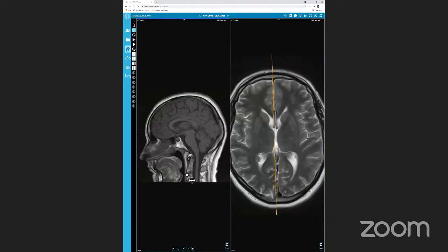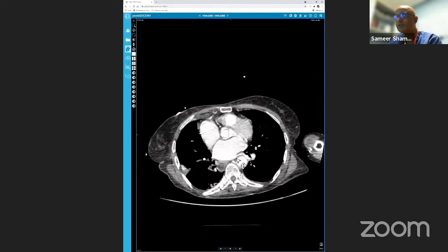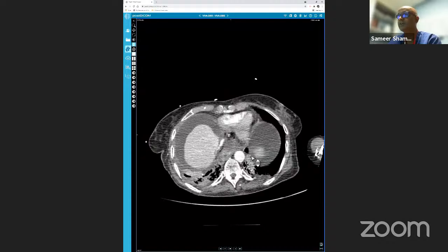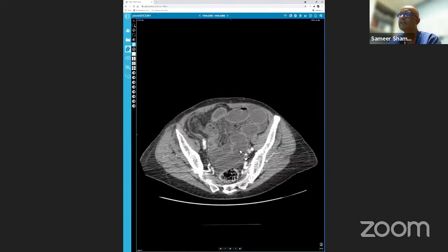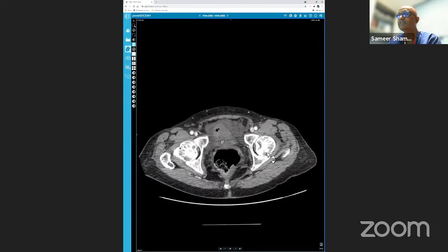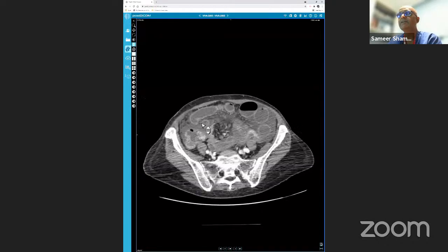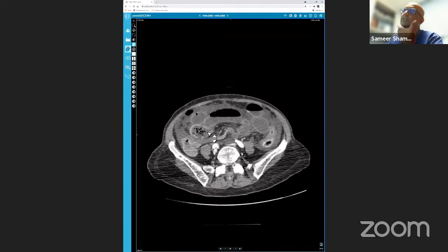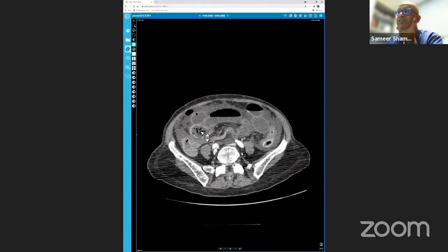Okay, so the mesenteric volvulus was really good. The teaching point on that one was to look for the site of transition, so you were spot on. You could say that there are multiple loops of dilated bowel with differential enhancement, and you identified the segment. I was very impressed, especially by the feces sign. You should always look for the small bowel feces sign, which will be just proximal to the site of obstruction.